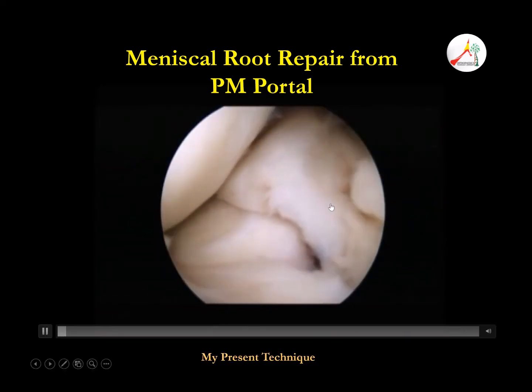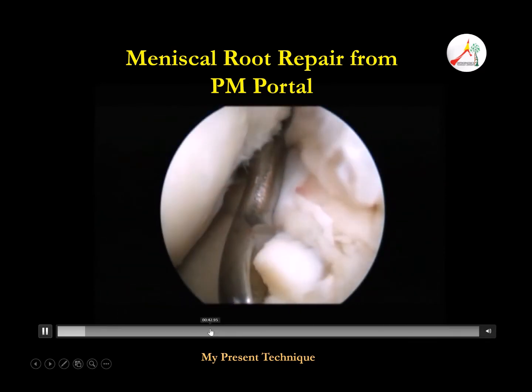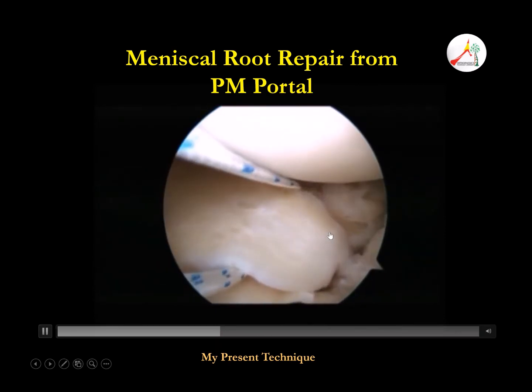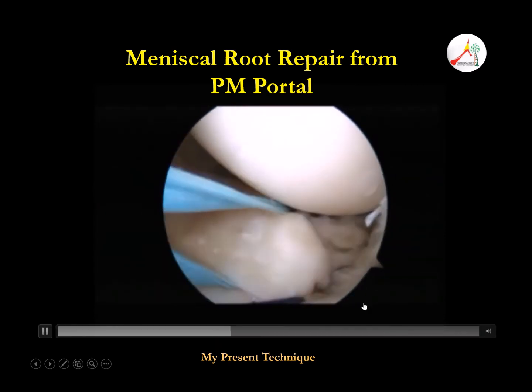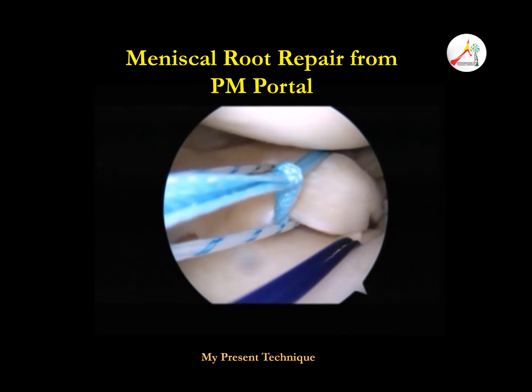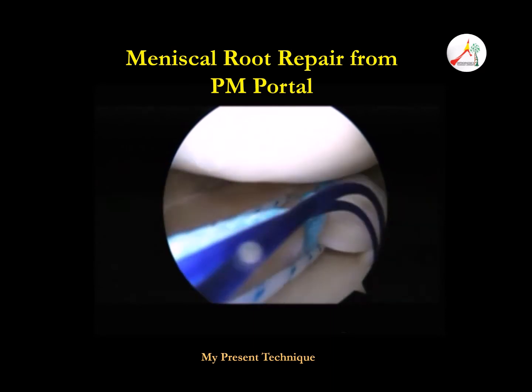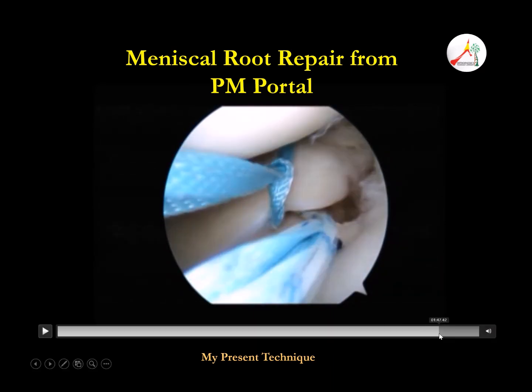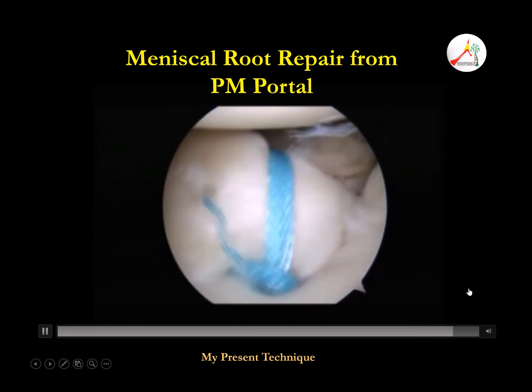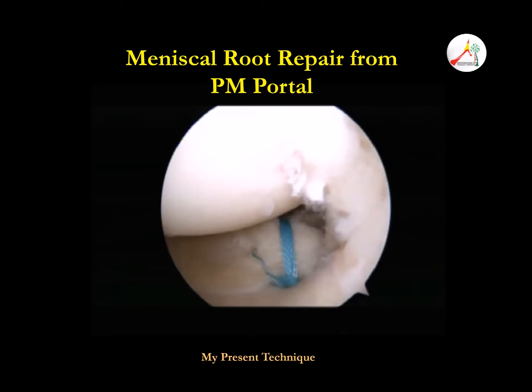Or you can make a hybrid, especially when you make a tunnel here from the back, make a raw surface, and then make a tunnel from the back and pass this suture in. So I told you, you can do it in many ways. You can do it from the front, you can do it from the back also. Pass this suture into the tunnel, and then suture to the post. And another thing is you have to be careful when you tie to the post, do not do it too aggressively. In the past, I tied too aggressively to the post, so the result was cut through the tissue. Just tie to the post, do not tie the knot aggressively.